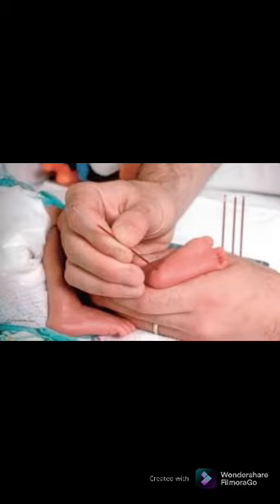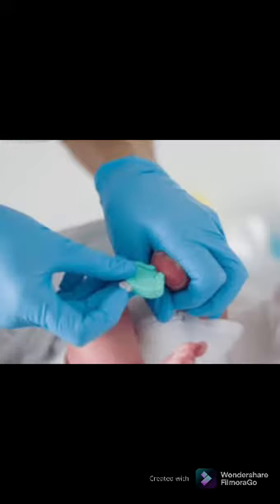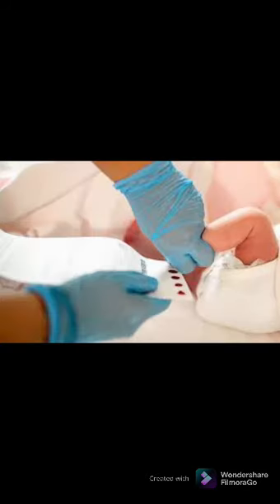Procedure for heel stick capillary puncture. Review the test requests. Approach, identify, and prepare the patient. Verify diet restrictions and latex sensitivity. Sanitize hands and put on gloves. Position the patient. Select the puncture site. Warm the site and clean and air dry the site and prepare equipment.